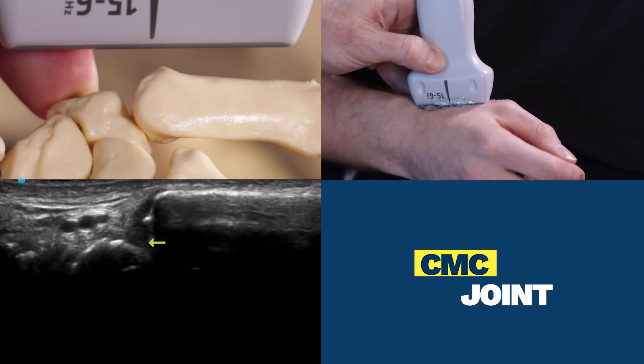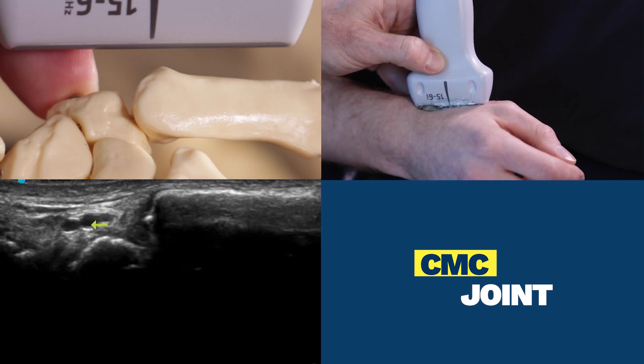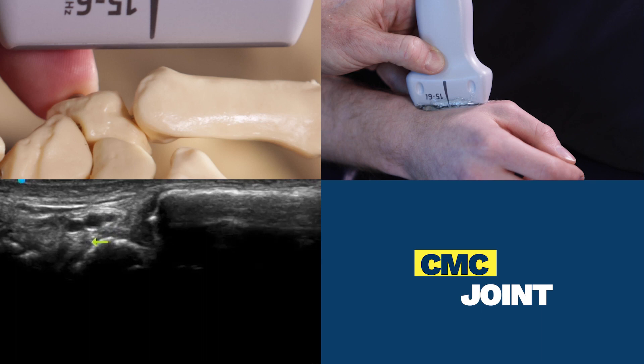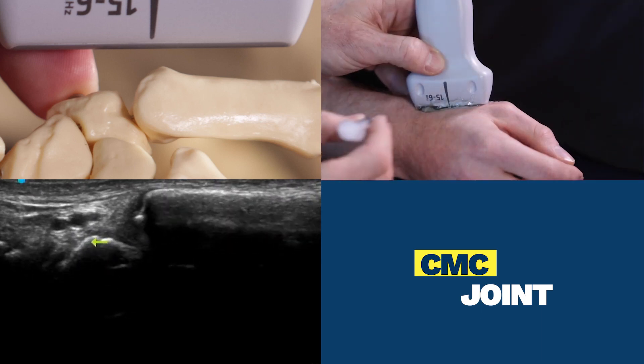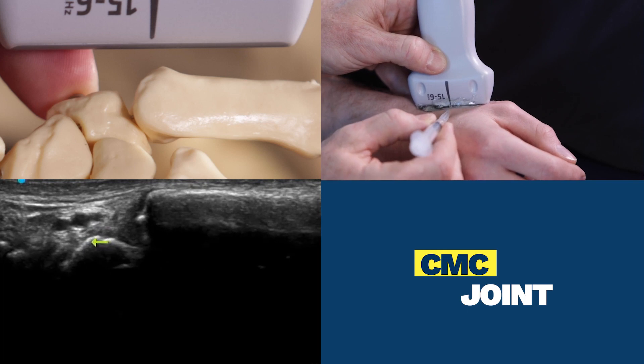In this particular patient, we can see the radial artery sitting just here. I can probably do the injection quite safely with a steady hand with my angle of entry like so.